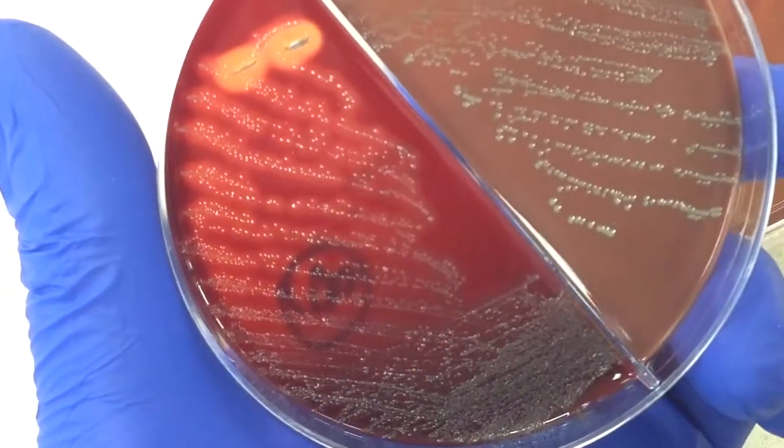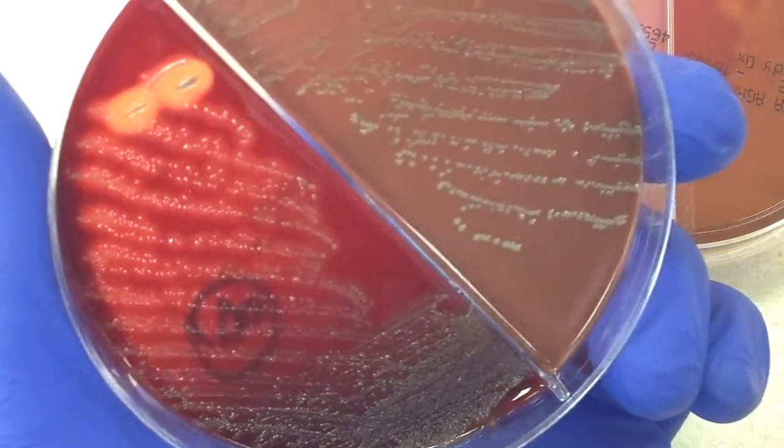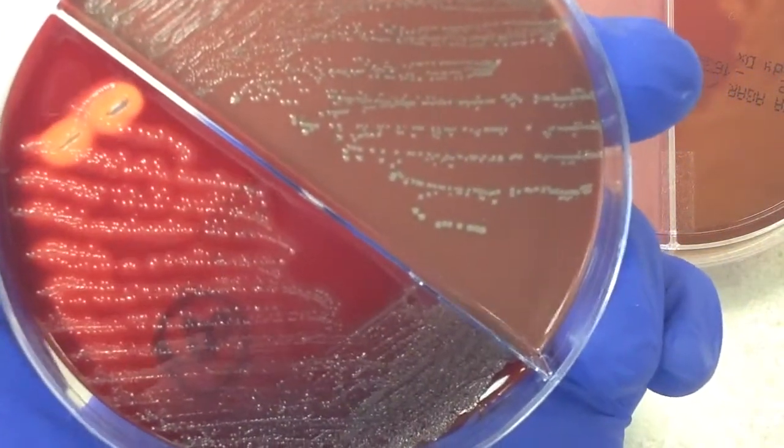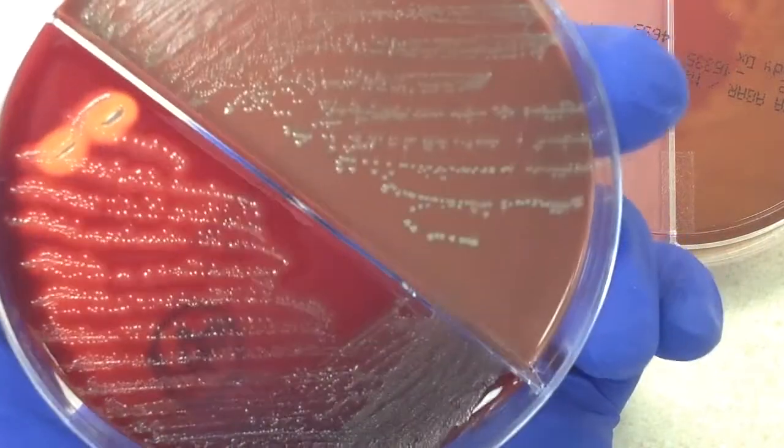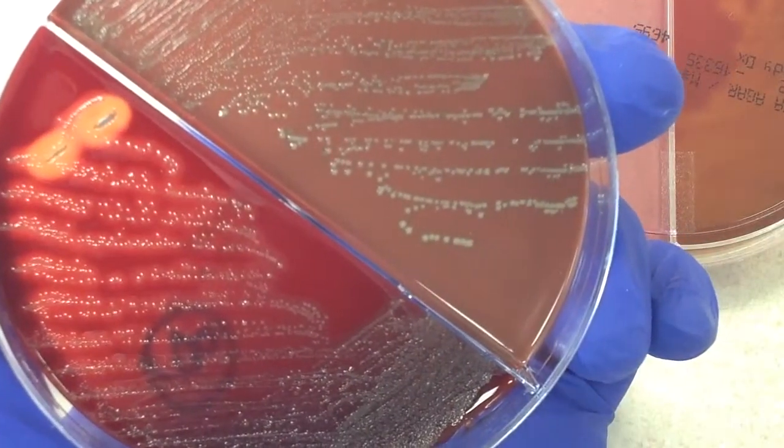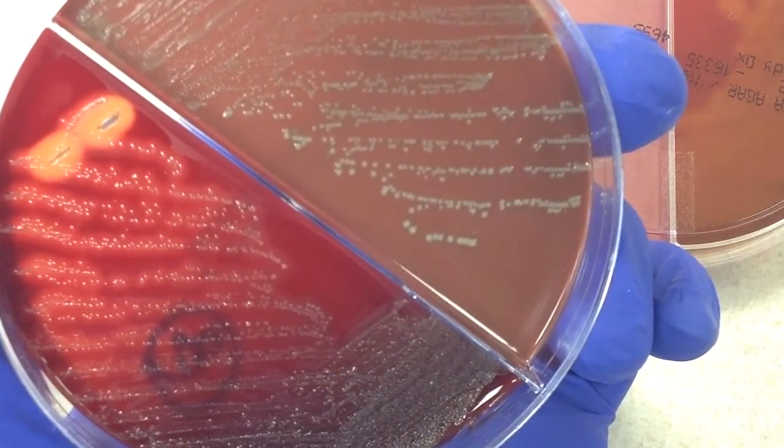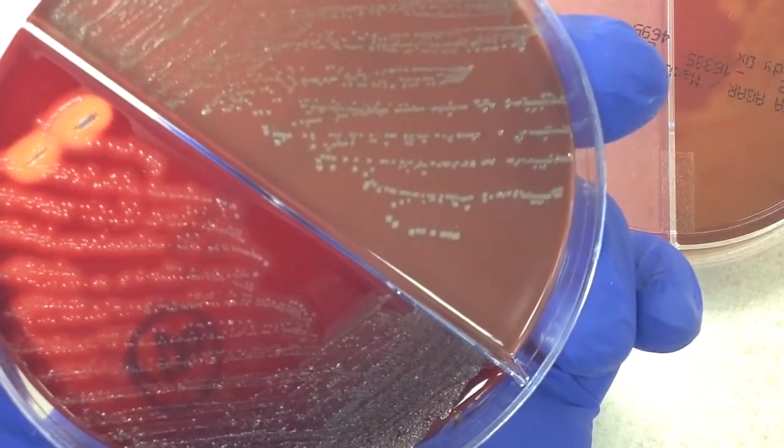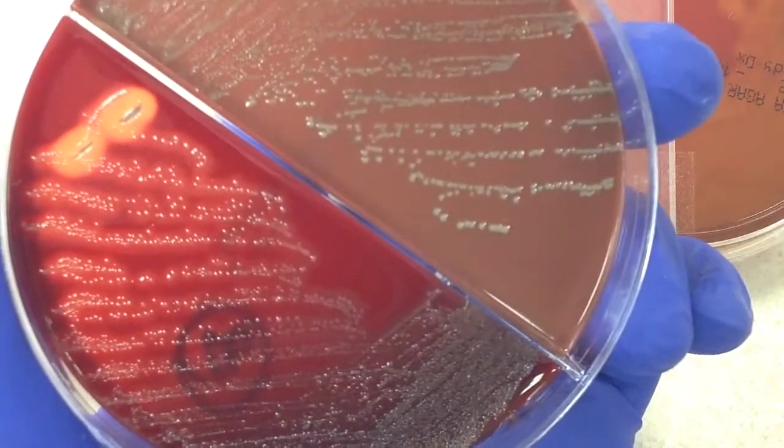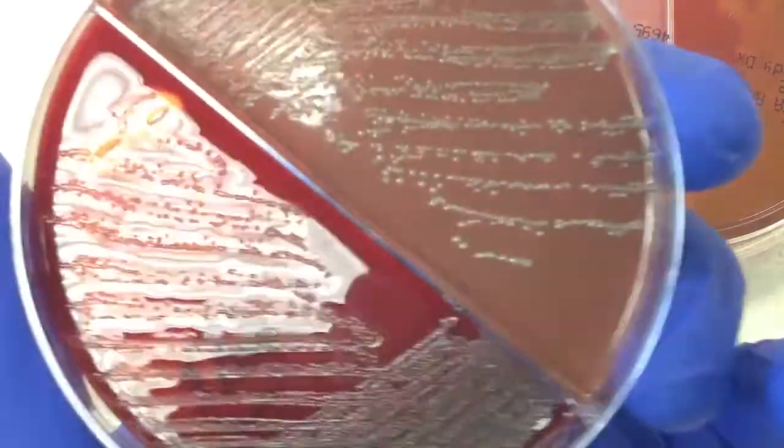So we're going to go ahead and we're going to work up these beta hemolytic colonies. Now we have to send a report out to the doctor, a preliminary report. So when we have cultures that are expected to have normal flora in our report, we're always going to comment on that.